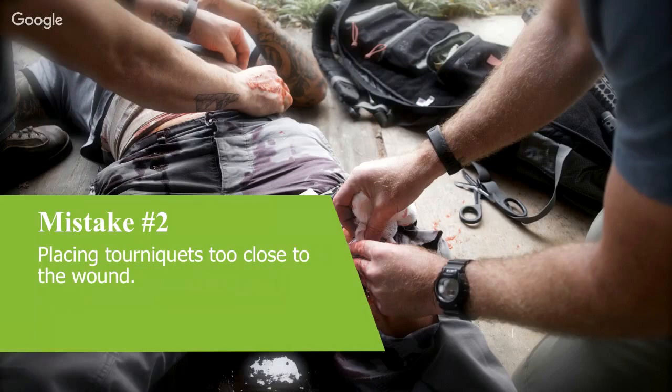So that's great. And if I can just respond to Dave's question there, talking about references and that 96% survival rate if a TQ is used pre-shock. To talk to that really quickly, there's been a couple of studies, Dave. The first that I'm aware of was done by Kragh et al. in 2009, looking at survival rates pre and post hemorrhagic shock. But we'll send out an email with a bunch of references on it rather than get caught up in that at this point. But cheers for that. Definitely.